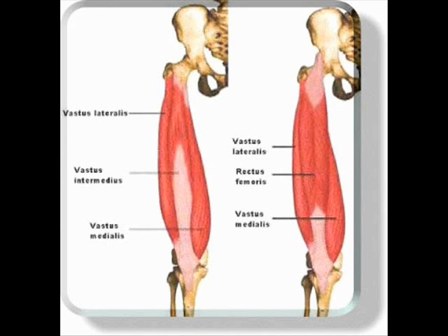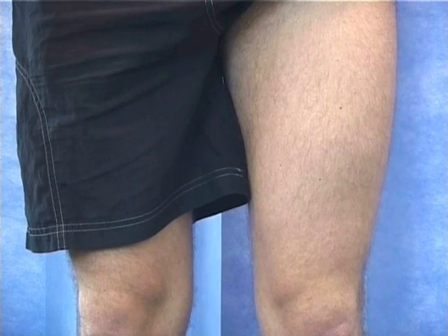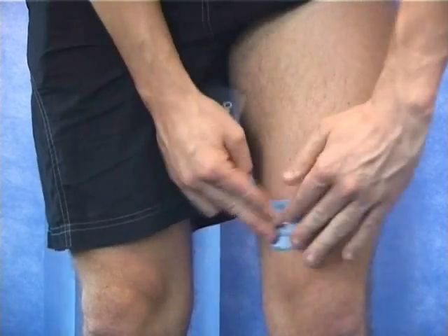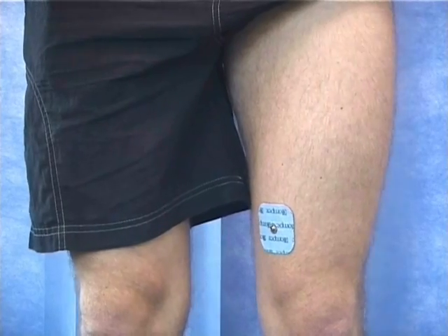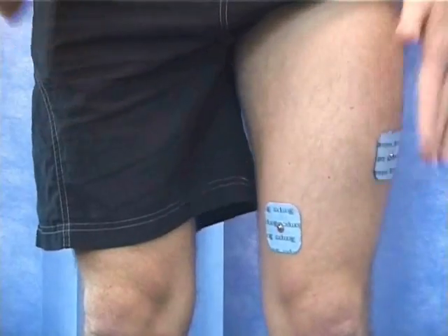First we need to place the electrodes in the correct way. Place the rectangular pad with the two connectors centrally at the top of the muscle. Place a square pad on the inside part of the muscle. Place another square pad on the outer side of the muscle but very slightly further up.